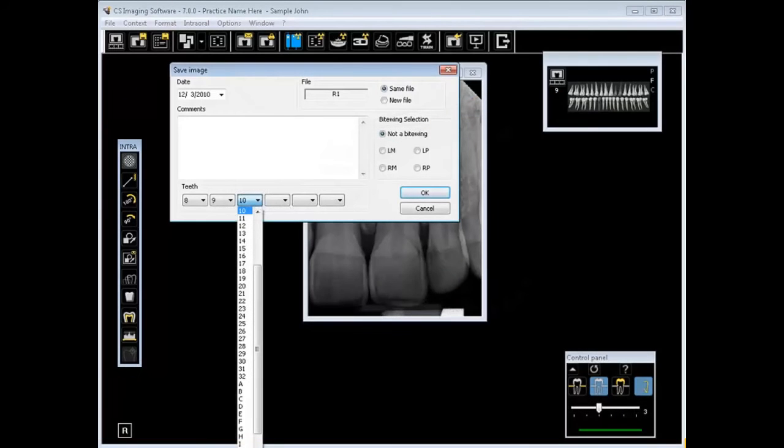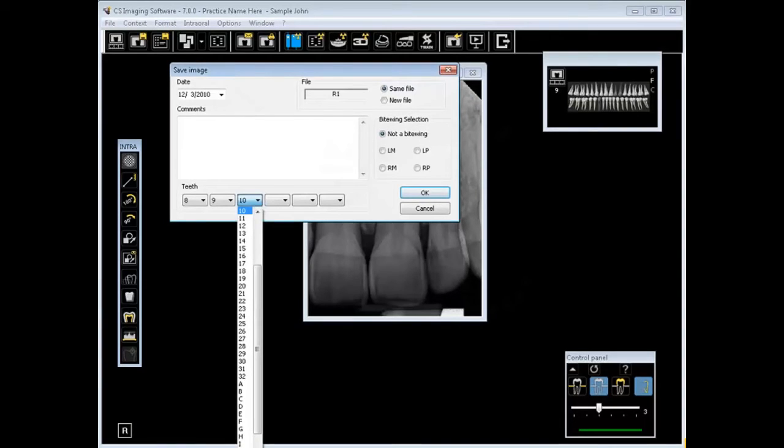Taking action from the file menu. When saving images, you can add comments to describe the file. To save an image, follow these steps and we'll take action from the file menu.